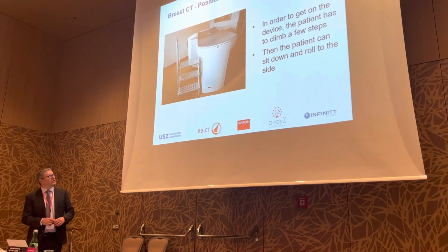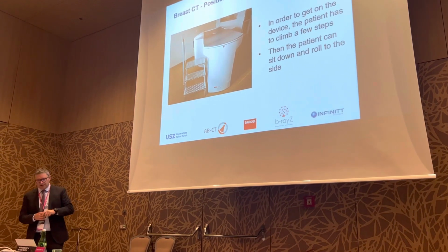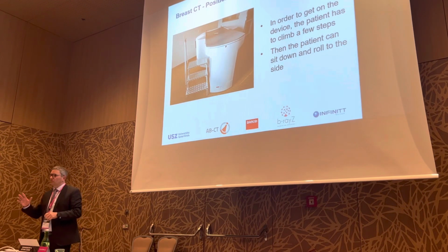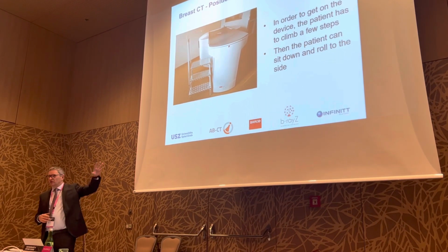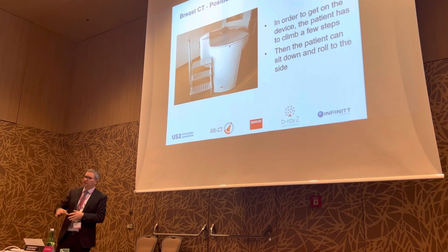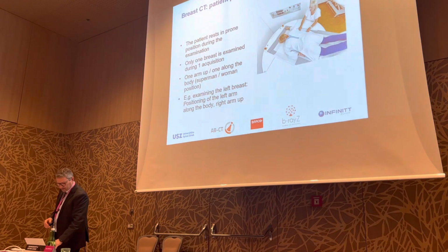So what has to be done for the examination? As a patient, you have to walk up that small ladder, and then you lie down on the patient table, and there is an opening. The breast must be introduced into the opening. So how is this done?